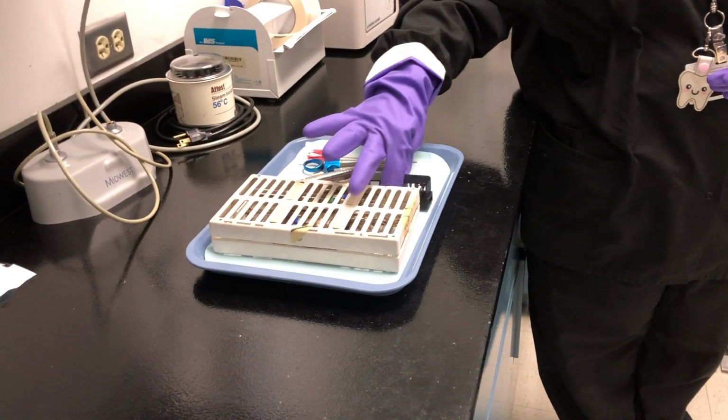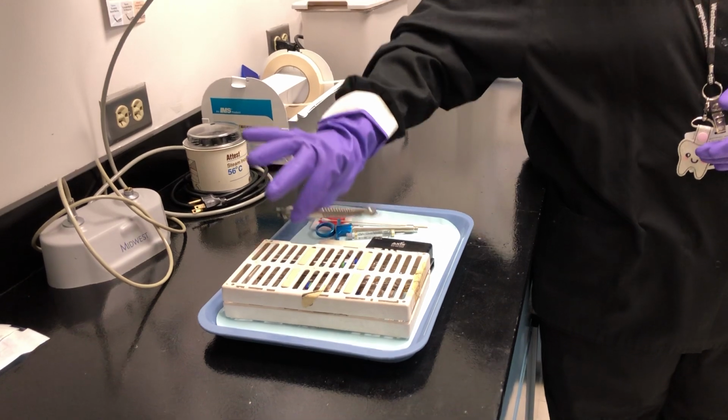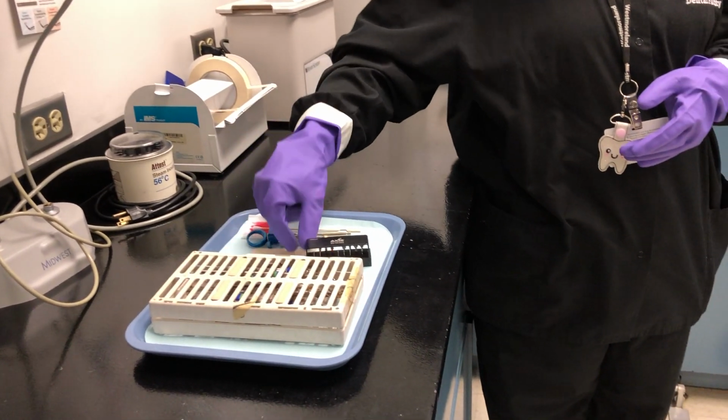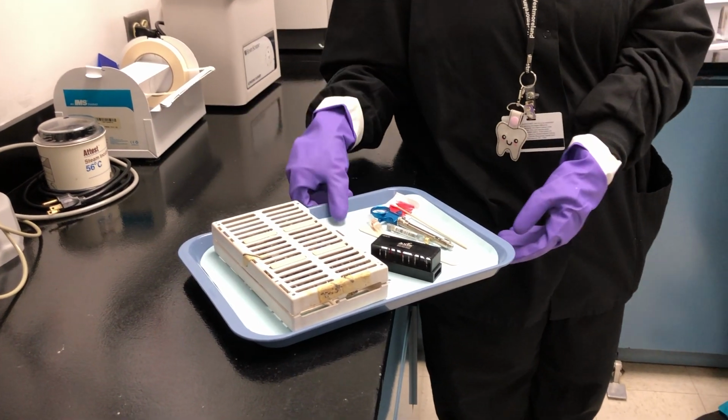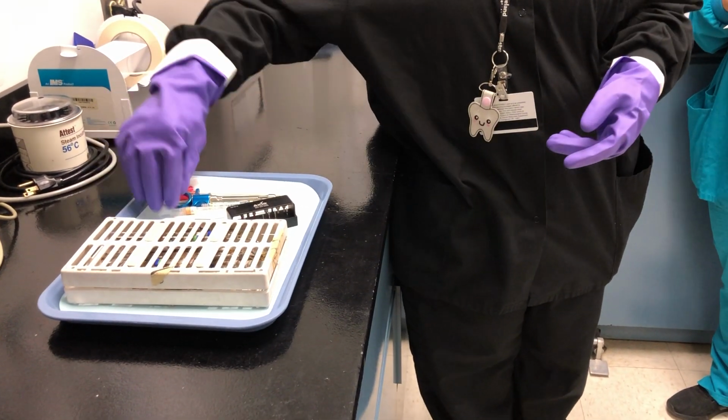So the next thing on here says dispose of sharps in the sharps container. What does she have from that patient that would be sharp? The needle. The needle, right. And where is the sharps container in here?